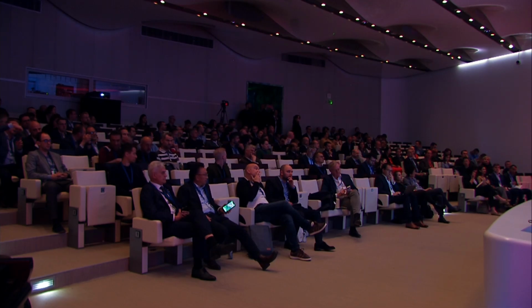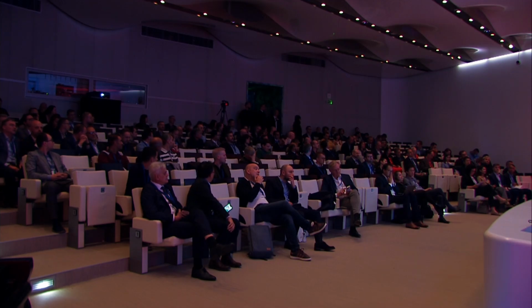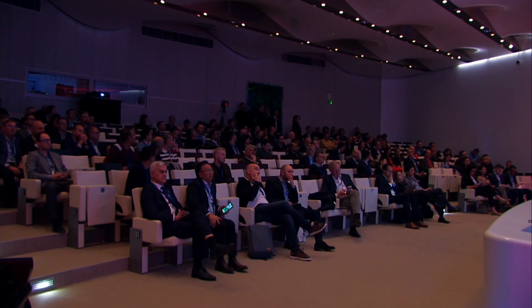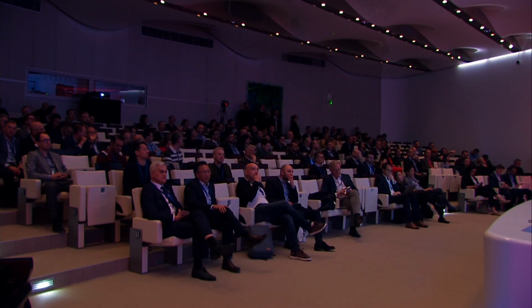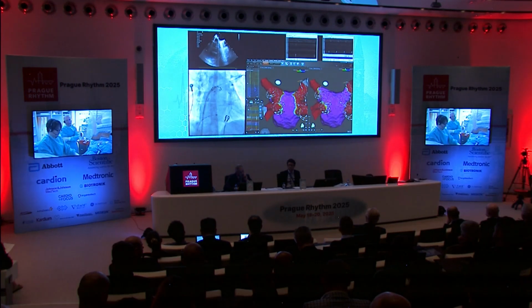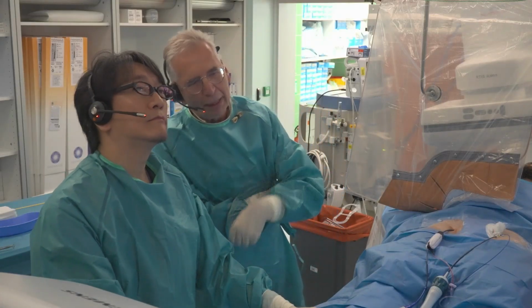Yeah, thank you, Professor. This is more a general question. I would like to know when you perform posterior box isolation, do you rely more on atrial size, on AFib duration, or on bipolar signals? And if on bipolar signals, do you study them during AF, or do you cardiovert the patient and remap in sinus rhythm? It's a very important topic you pick up.